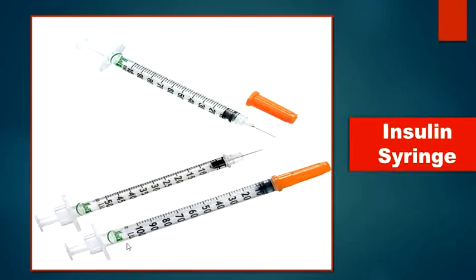It's used for small doses, yes. Very good. Small doses of a drug. Like what? Do you have an example? Epinephrine, heparin.